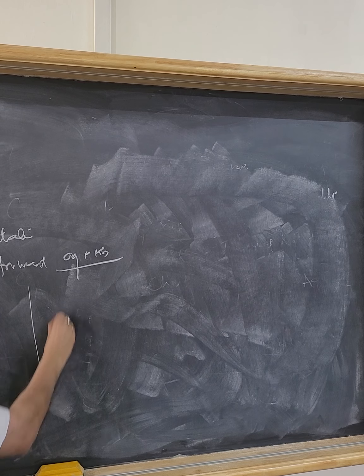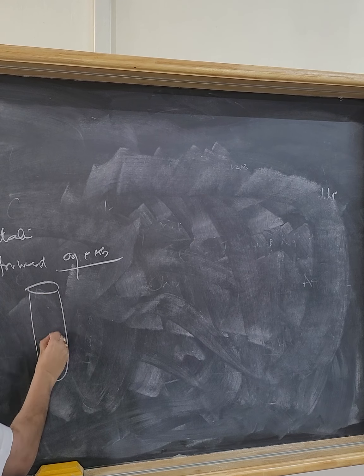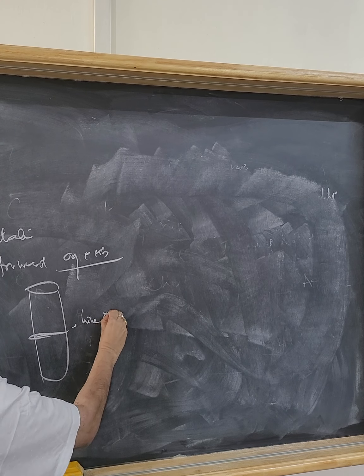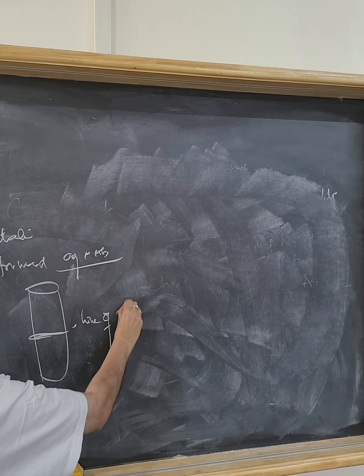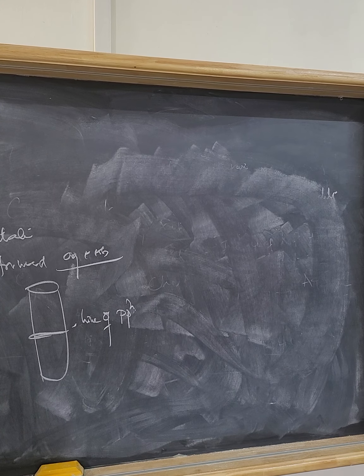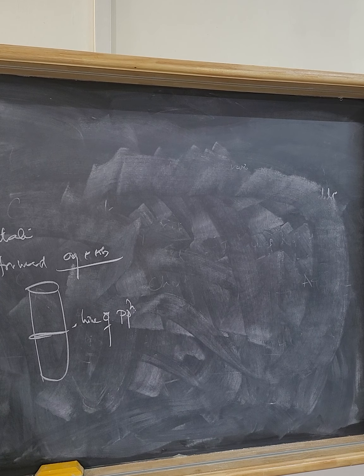If you do it in a liquid, there will be a line of precipitation.